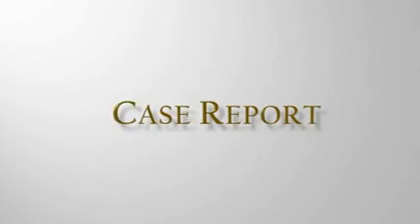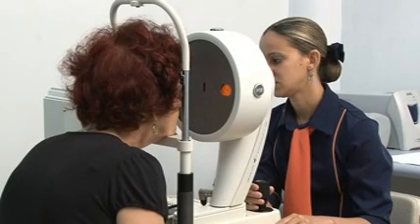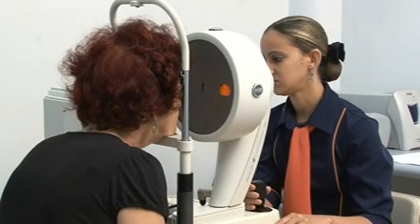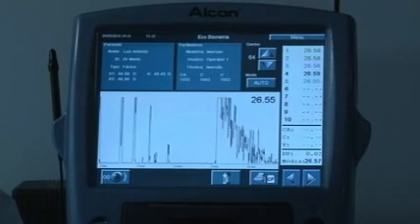In this video, we present a case of a patient with posterior amorphous corneal dystrophy and cataract submitted to phacoemulsification and bifocal intraocular lens implantation. Preoperative biometric parameters were obtained from the Scheimpflug system and immersion ultrasound biometry.